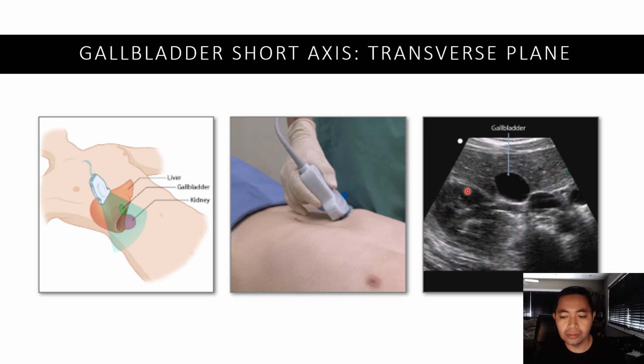The gallbladder is the most anterior anechoic structure. Next to it, posterior medially, is the vena cava. The IVC and the right kidney are also important landmarks here to help with localization of the gallbladder. After gallbladder identification, one may fan through it from the neck to the fundus.